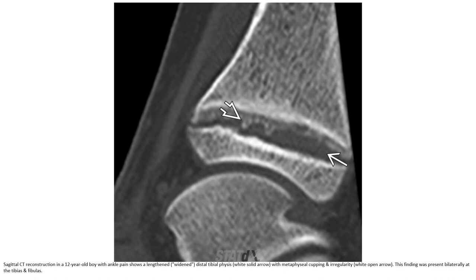Sagittal CT reconstruction in a 12-year-old boy with ankle pain shows lengthened distal tibial physis with metaphyseal cupping and irregularity. This finding was also present at the tibial-fibular level.